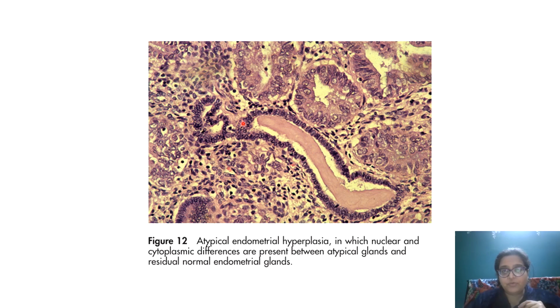Again here you see this very dark blue color with palisading. This is how an atypical gland looks. So when I see this, I become more alert, this kind of pencillate dysplasia, rather than when I was showing you the crowding before this, where the cytoplasm was ample. Here also the cytoplasm is ample, but see, the nucleus is becoming very pleomorphic. To me, a more striking feature of dysplasia is this kind of nucleus. In a specimen where you are getting dysplastic epithelium, this gland is going to become dysplastic, and this has totally become dysplastic. So this is an atypical gland.